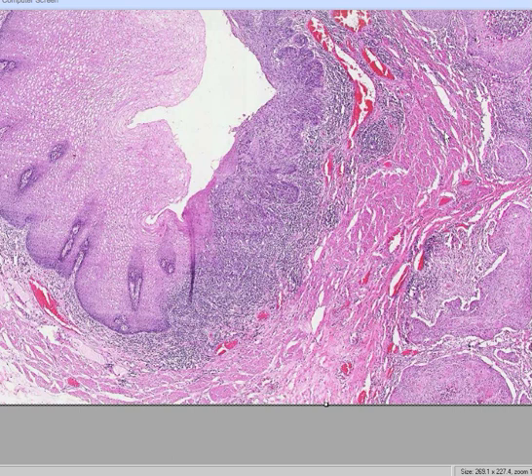And let's say you very carefully go through this muscle and you say, well, yeah, this is a smooth muscle, but let's say you find some striated skeletal muscle in there too. So here's my question. Is this the lower part of the esophagus then, or is this the upper part? Of course, it's the upper part. Thank you. I think you're all picking up the general principles.